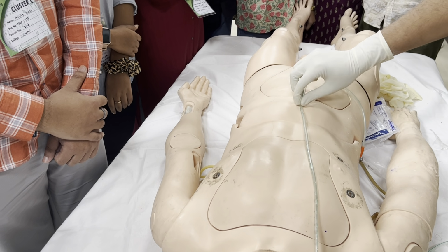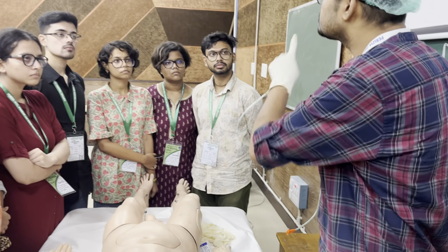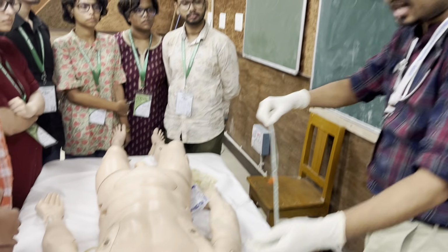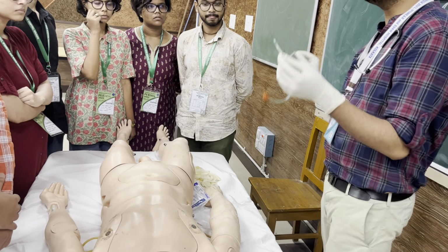If you introduce this much, the tip will be inside the stomach. But you should not touch like this as I am showing, because it will be unsterile. So just take an approximate measurement. Okay, so I have taken the measurement.